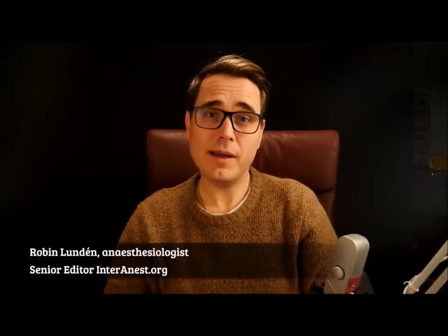This video is a demonstration of techniques that can be used to intubate patients with a suspected COVID-19 infection. It's been produced by my friend Dr. Lucas Candler, who's a consultant anesthesiologist in Zurich.